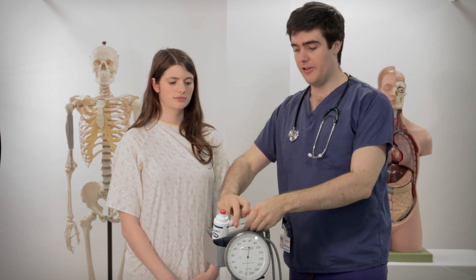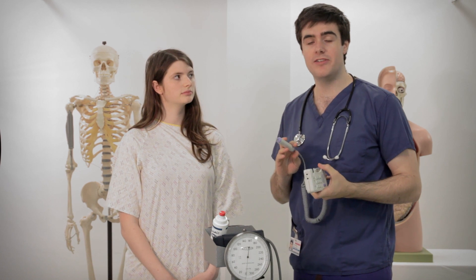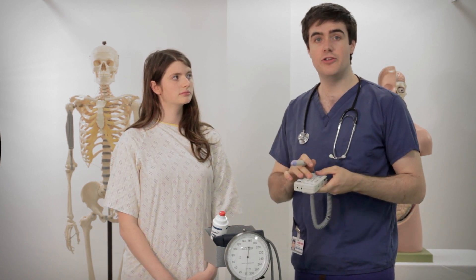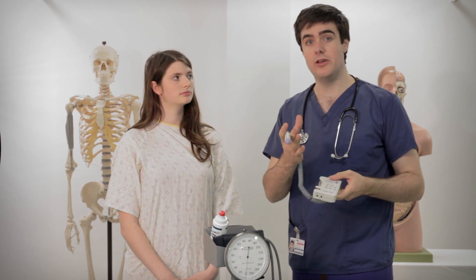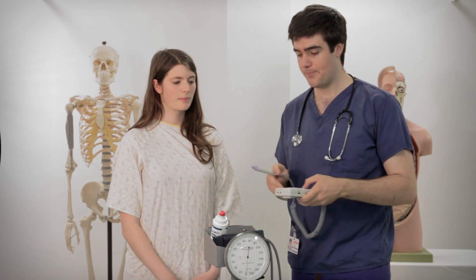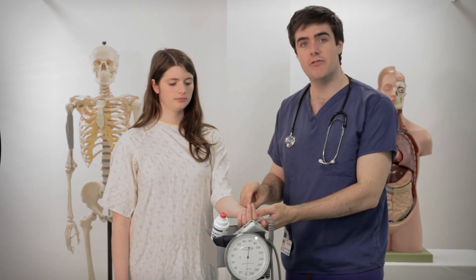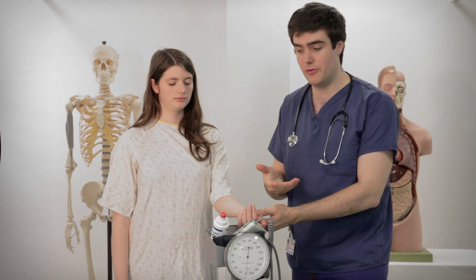Instead we're going to use one of these. This is a Doppler ultrasound probe which is another way of listening to blood vessels, but this makes a noise every time you hear a pulse and that means that you and Sophie, who's going to be our patient today, can hear what I'm doing at the same time. So the first thing I need Sophie is just your wrist please. We're going to listen at the radial artery at the wrist, which you might be used to measuring your pulse normally.